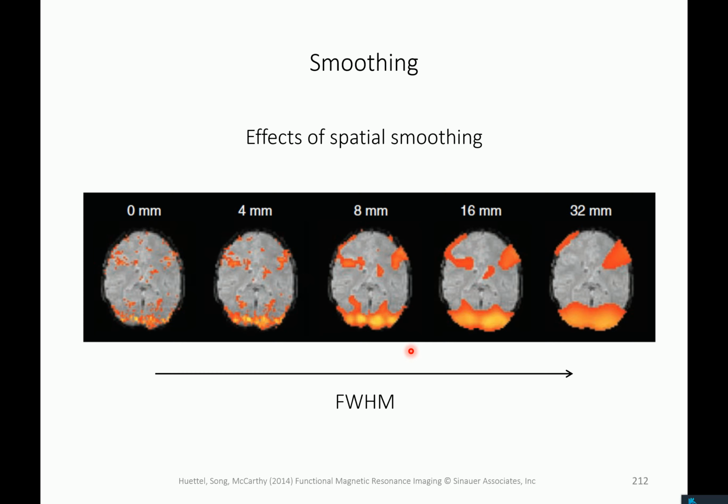So you apply a filter for every data point. No, you shift the filter. Okay, but for every data point. Yeah. And that's just filtering. If you do this with a broader filter window, of course you will take more data from adjacent sites into the data point that you then allocate to a given site. You have a running average, and the running average just takes data from more sites. But this is filter theory.